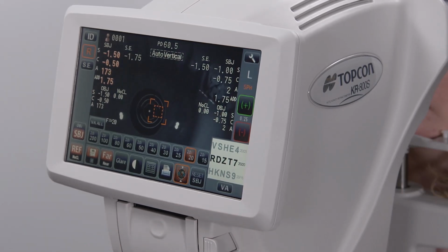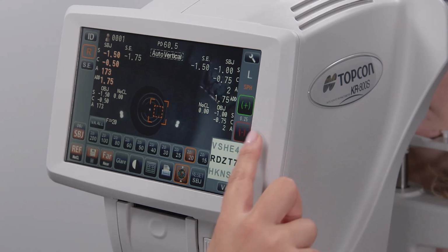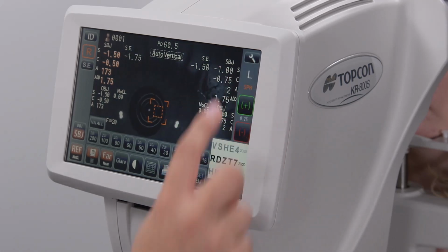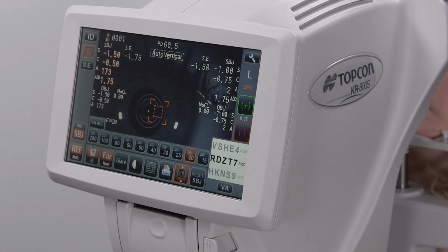If desired, you can use the plus and minus icons to adjust the spherical power. However, unless you're familiar with refraction techniques, it's best to leave these alone. Note that the cylinder power and axis cannot be adjusted. Select the other eye and repeat these steps to determine and record the visual acuity of that eye.